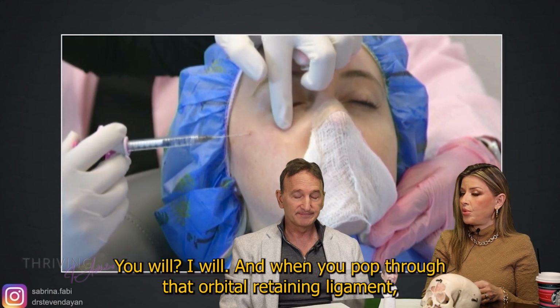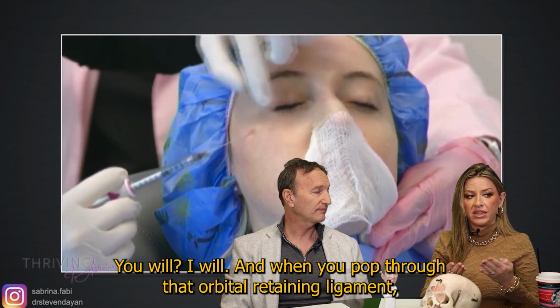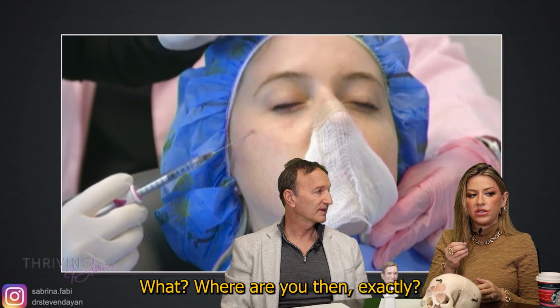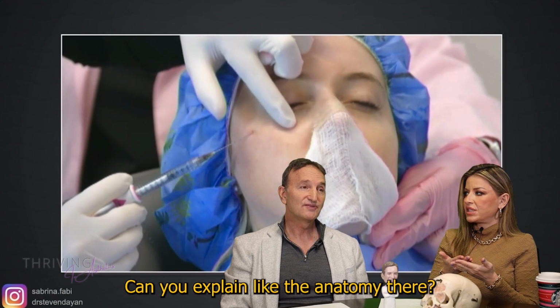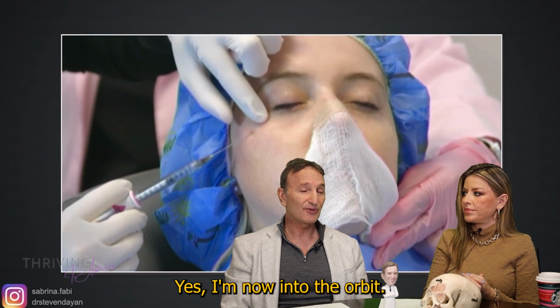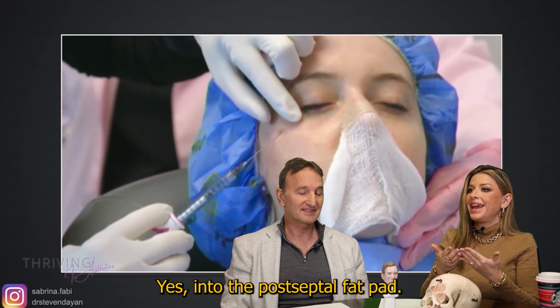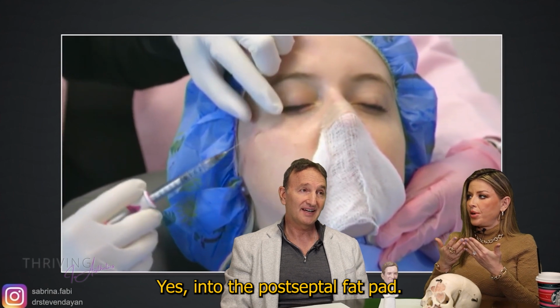You will. I will. And when you pop through that orbital retaining ligament, which I think you're doing right here, yes, you see me wiggling my way through right now. Where are you then exactly? Can you explain the anatomy there? Yes, I'm now into the orbit, behind orbicularis oculi, into the postseptal fat pad.